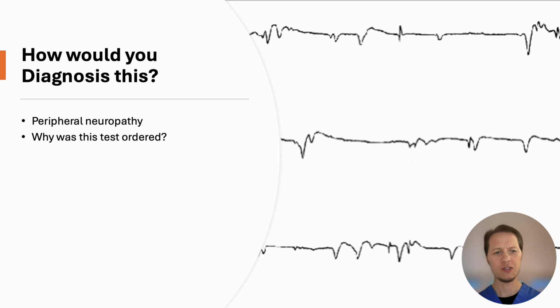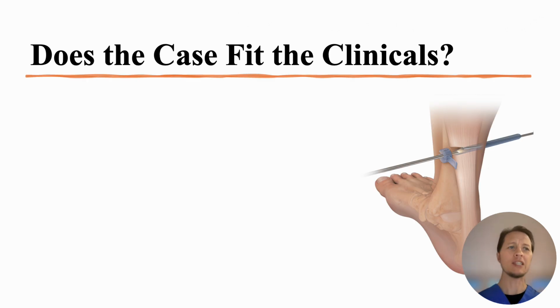Now, this is the whole point here. Why are we doing this? What do we not have yet? We don't have the clinicals. And well, I was saving it because I just wanted to. That's what makes these cases interesting. What the heck is going on here?